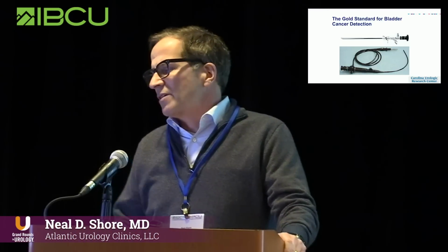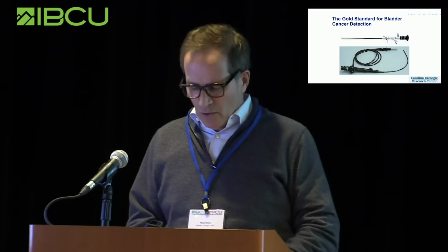So the gold standard for bladder cancer detection is something we're all very familiar with. We see the rigid cystoscope and flexible cystoscope and white light. And let me be perfectly clear, it still is the gold standard, but the real question is, can we do better? There are so many disruptive technologies, markers, imaging, and therapeutics which are going to be discussed, and the data will be reviewed at this meeting, which is really why this is a great meeting.